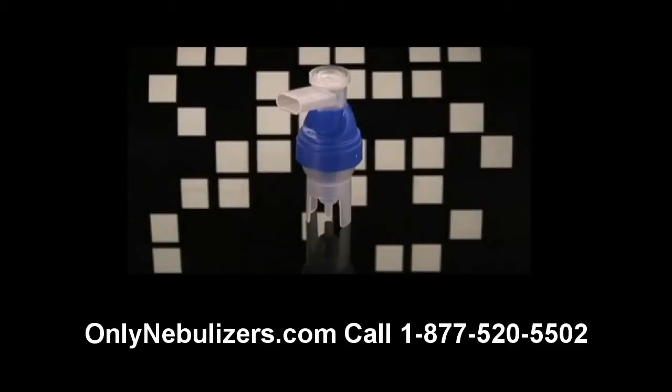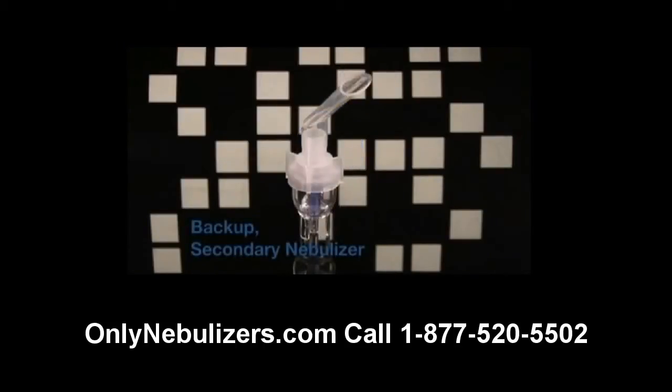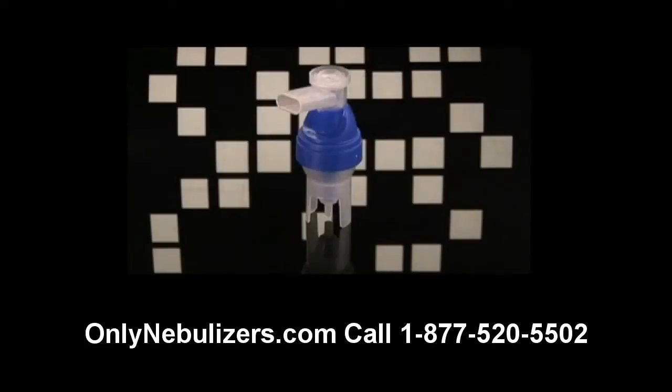You may have received a DeVilbiss reusable nebulizer in addition to a disposable nebulizer with your Traveler. The reusable nebulizer should be used as your primary nebulizer. The disposable nebulizer was provided as a backup nebulizer should you lose or damage the primary reusable nebulizer. Please note that the reusable nebulizer provided with your unit may look different from this one. Also, in the future, you may receive a nebulizer from your provider that looks different from those featured in this video. However, the care and use of most reusable nebulizers is similar.